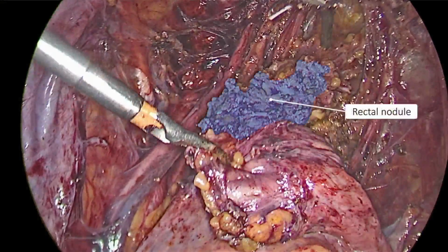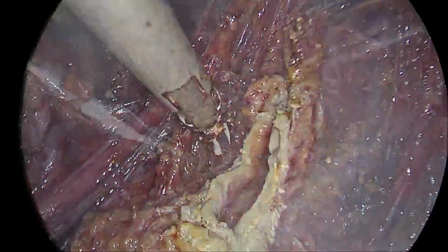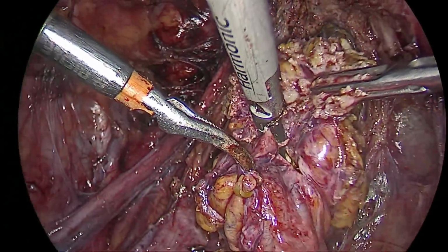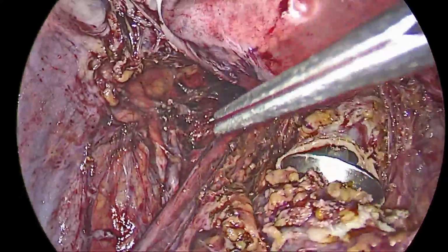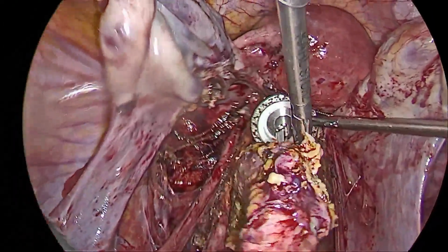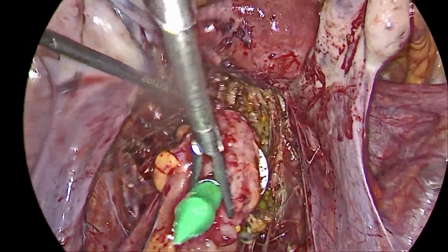Two rectal enterotomies are performed next, as shown by the dotted lines. The first enterotomy is performed near the distal margin of the nodule for the insertion of the anvil. A second enterotomy is performed at the proximal margin of the nodule for the anvil's later placement. Through the distal enterotomy, the anvil is inserted inside the abdomen. The anvil is then passed through the proximal enterotomy and is secured to the healthy proximal bowel edge by piercing the sharp tip through the anterior rectal wall.